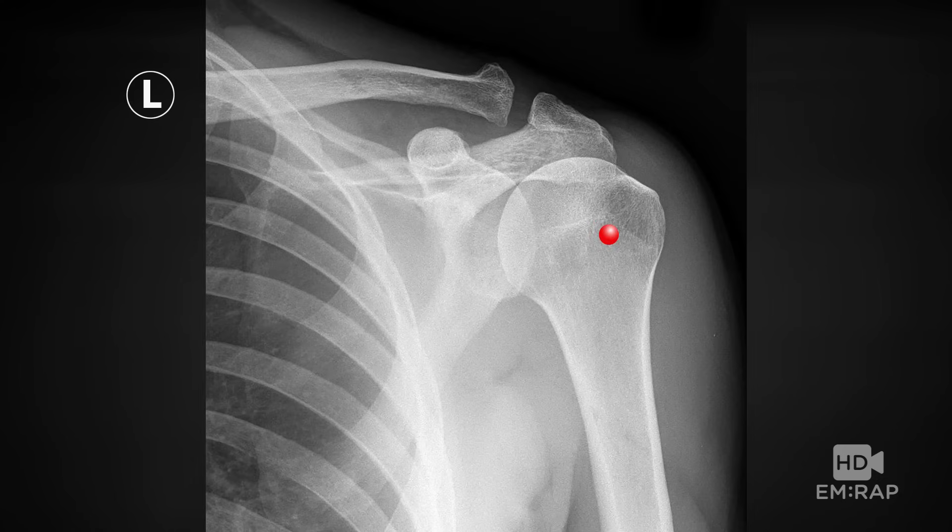And finally, there's the humeral head. You're going to go in the greater tuberosity of the humerus.